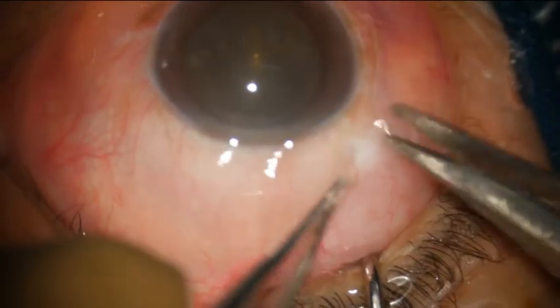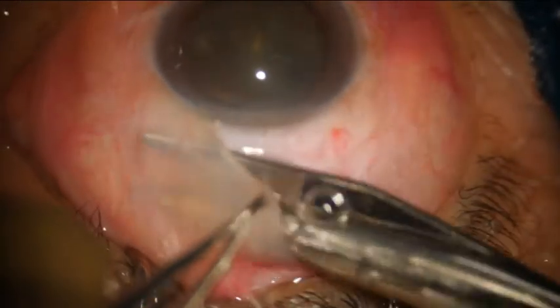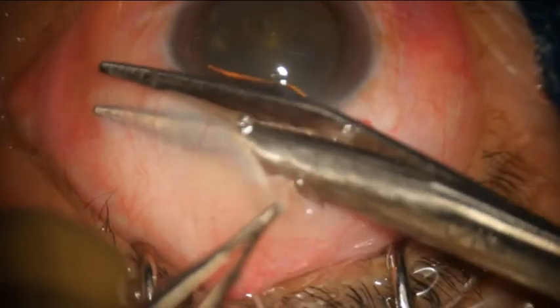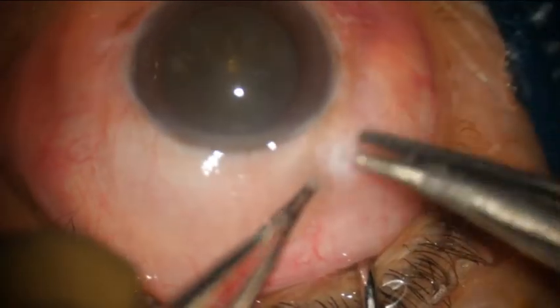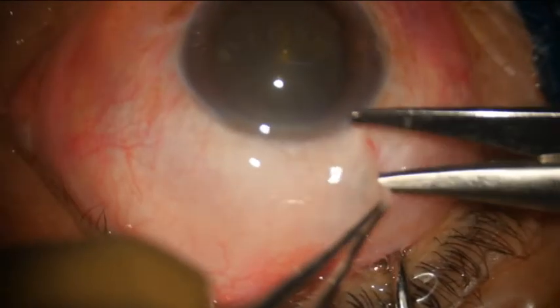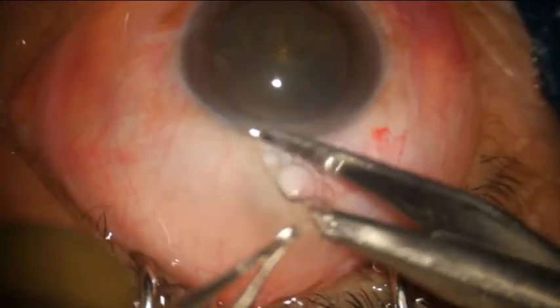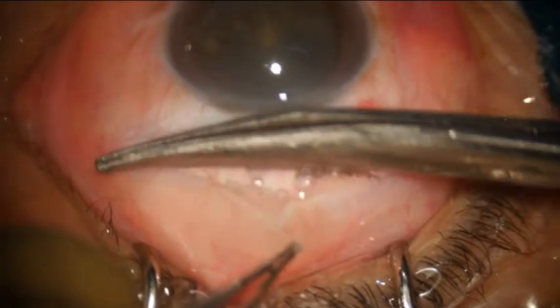This is a video recording for small incision cataract surgery. The conjunctiva is opened with waistcoat scissors, making a sufficiently large opening after ballooning it up with local anesthesia. You can use your choice of anesthetic — I prefer a peribulbar block, but you can do it even under topical.